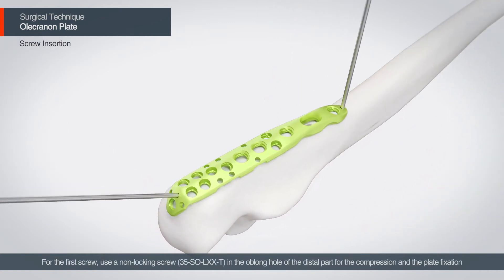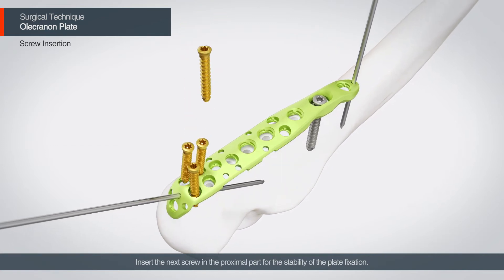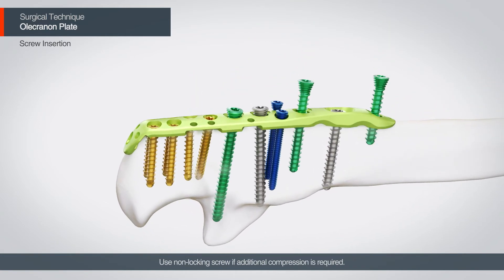For the first screw, use a non-locking screw in the oblong hole of the distal part for compression and plate fixation. Insert the next screw in the proximal part for the stability of the plate fixation. Use a non-locking screw if additional compression is required.